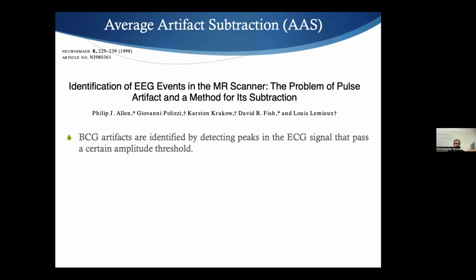So a few methods, basic methods. So this is still the main method that has been used and that is still being used. It's old, you see, it's 98. It's still being used as the standard method in all EEG-fMRI software. So first, the gradient artifact is measured by averaging the artifact and subtracting it. And you can do the same for the ballistocardiogram. So you take every QRS, you record your signal, you make a template, and you average and remove it. So it works, it's a channel-wise artifact subtraction.